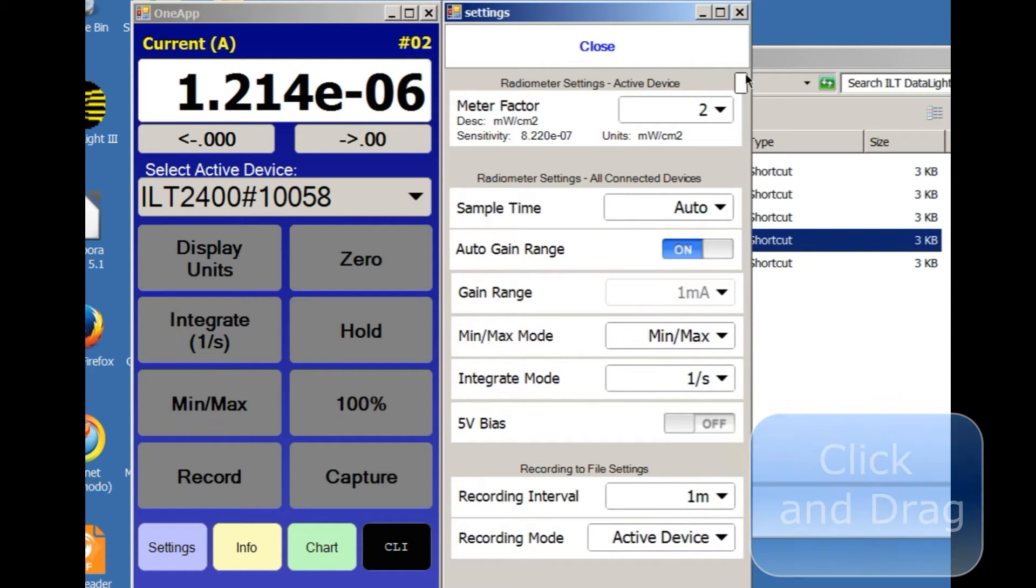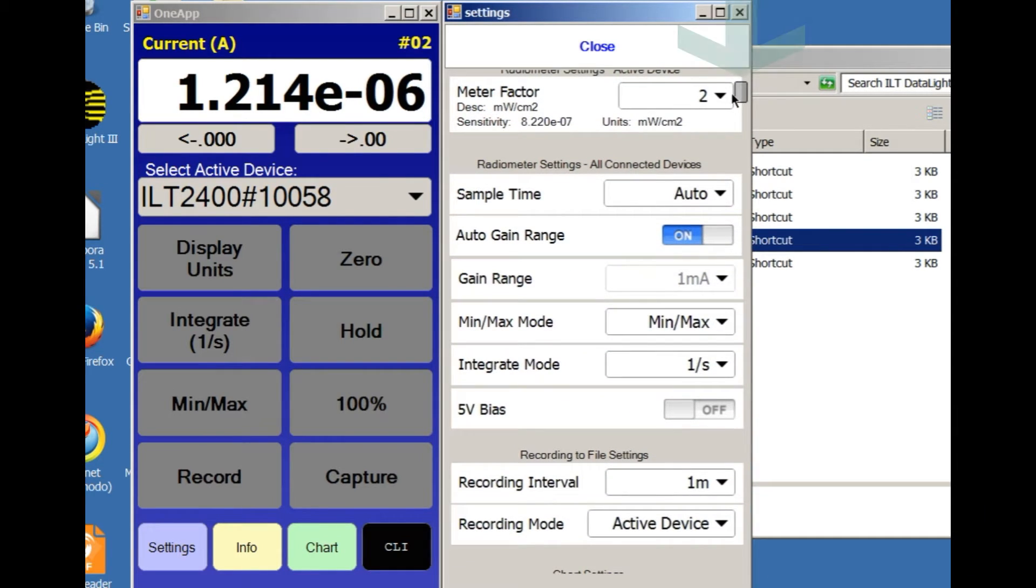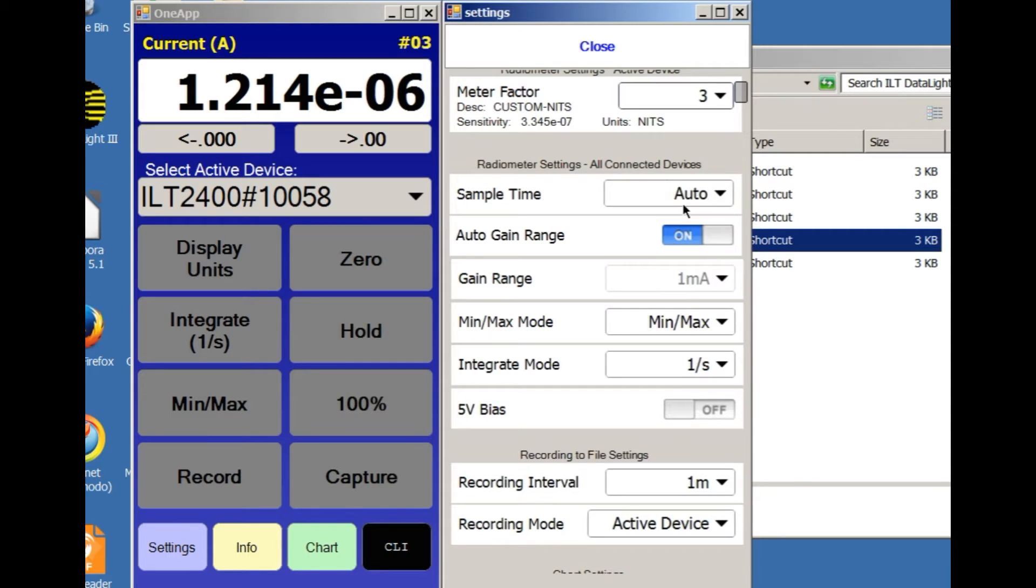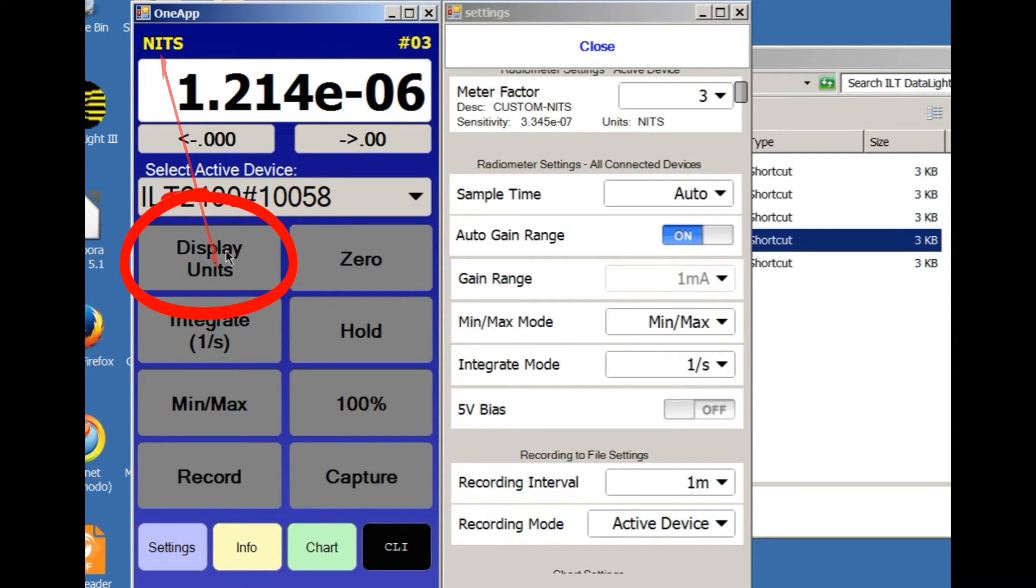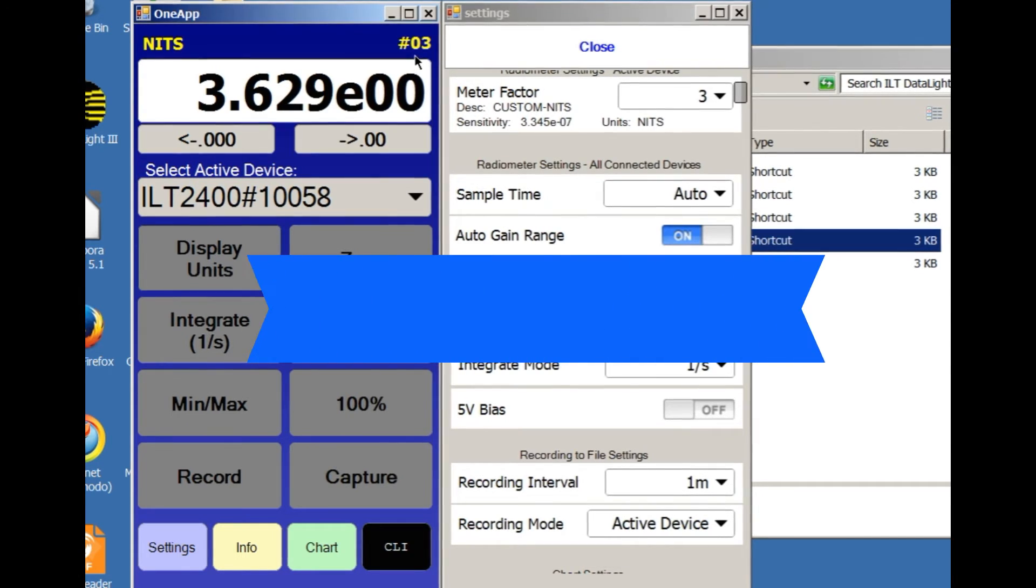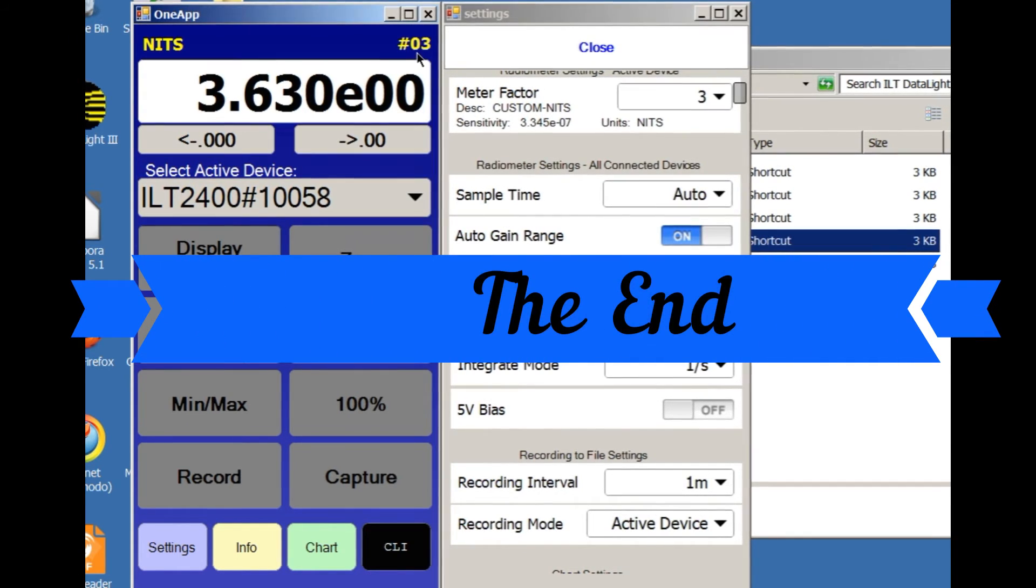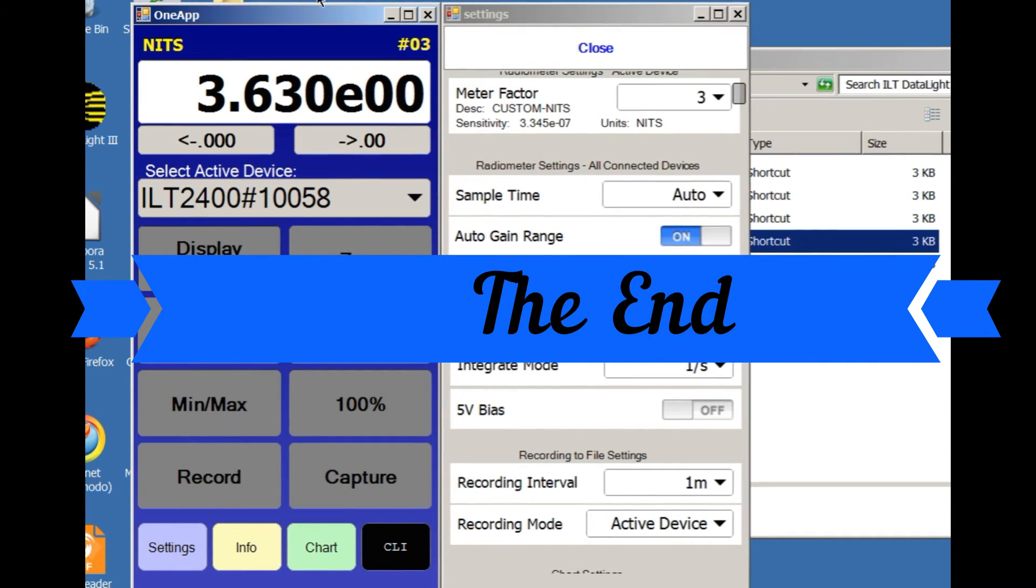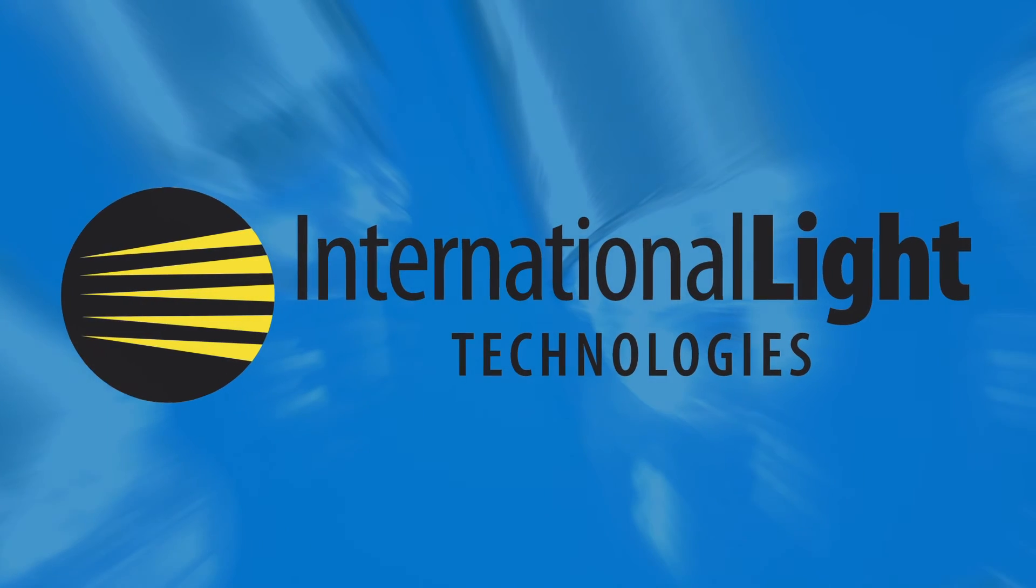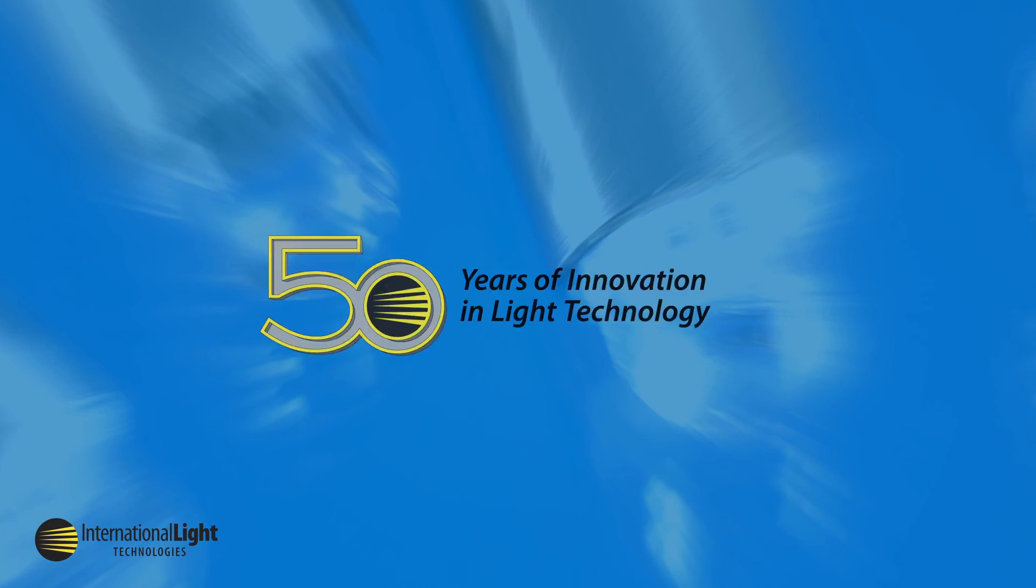Then, scroll back up to the top of the Settings window and select the new calibration factor, in this example Factor 3, in the Meter Factor select box. The new factor will now be applied when the display is set to light level readings.